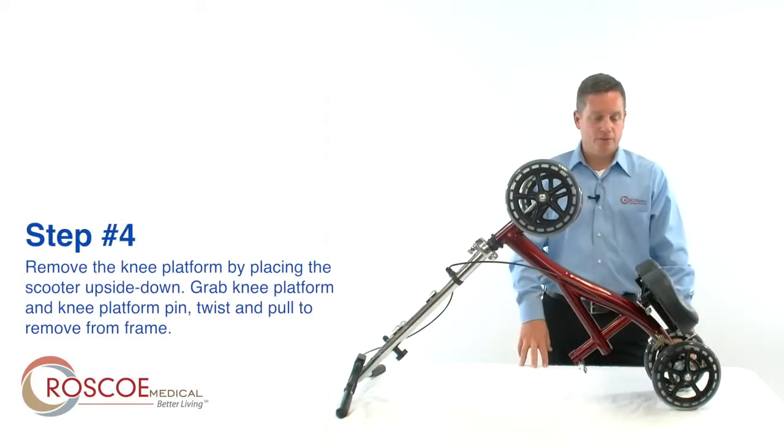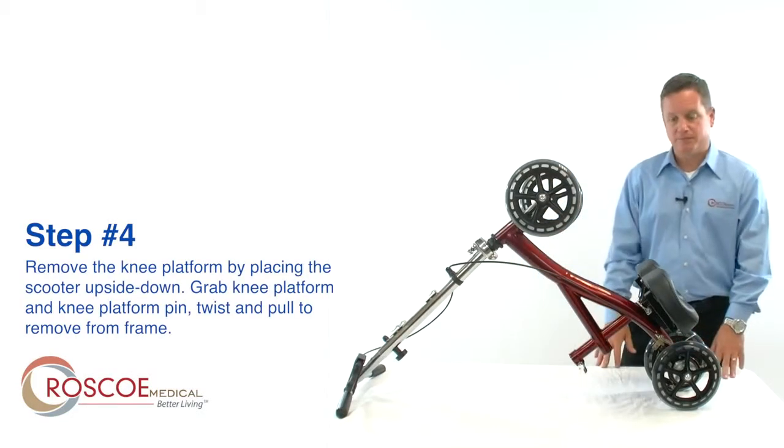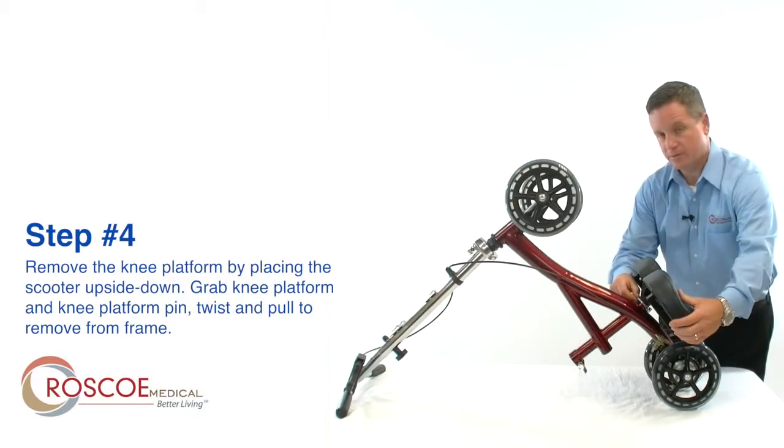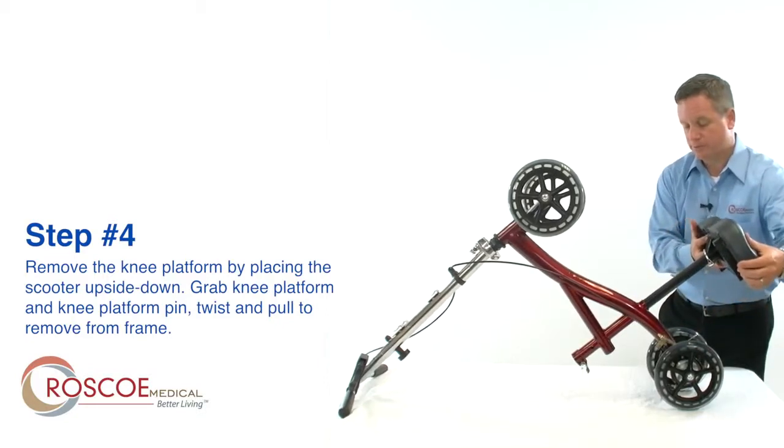Step 4: to remove the knee platform, place the Knee Scooter upside down. Simply grab the knee platform along with the knee platform pin, twist and pull to remove from the frame.